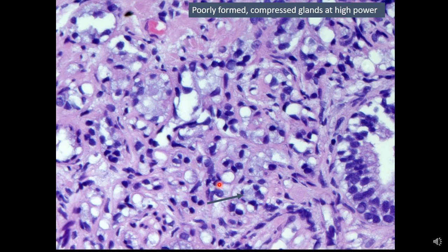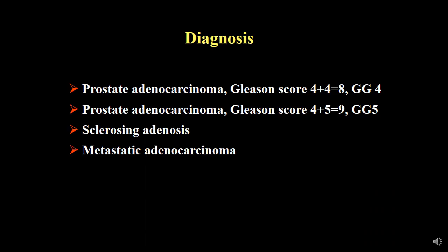You can also see some blue mucin in some of these glands, and also notice the stroma surrounding these glands appears to be very hyalinized and eosinophilic. The typical differential diagnosis in this type of case would include prostate adenocarcinoma grade group 4, grade group 5, benign sclerosing adenosis, and metastatic adenocarcinoma.